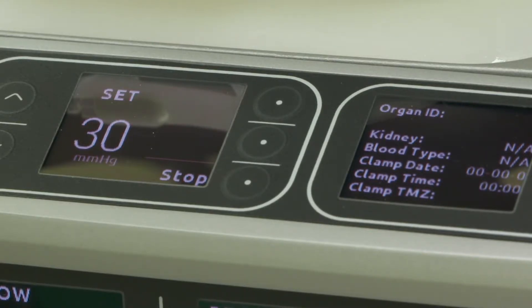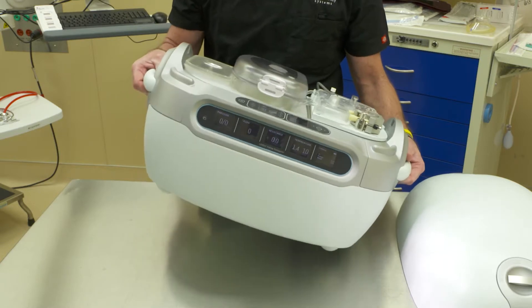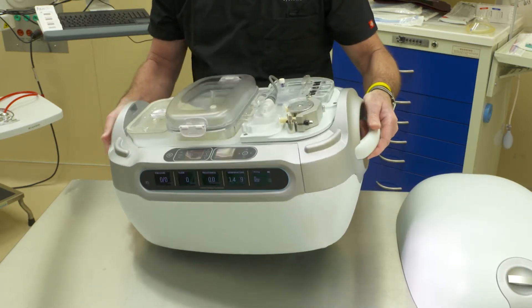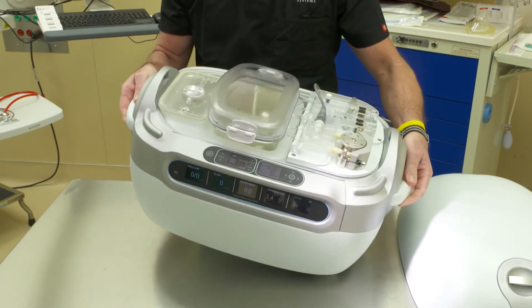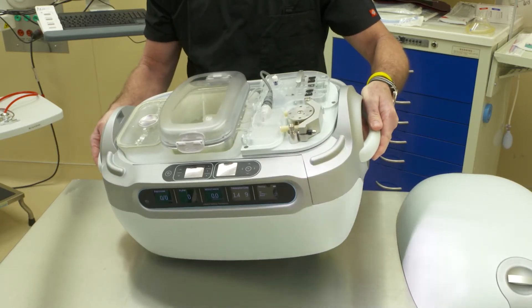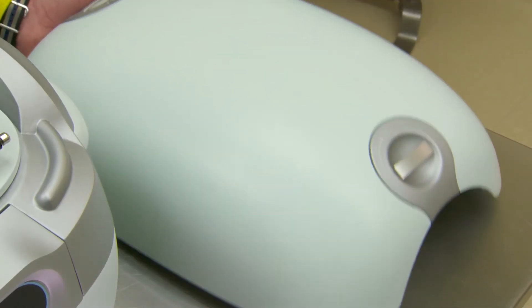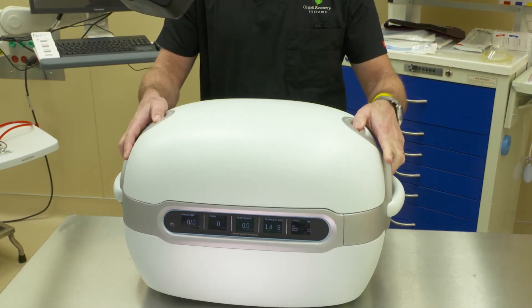Once the bubble trap is filled with solution and solution starts to come from the wash port back into the reservoir, using a slow 45-degree rotation, rotate the Lifeport unit to expel any ancillary air that may be in the Micron filter. Upon completion, replace the outer insulated cover on the Lifeport unit to help with ice longevity.